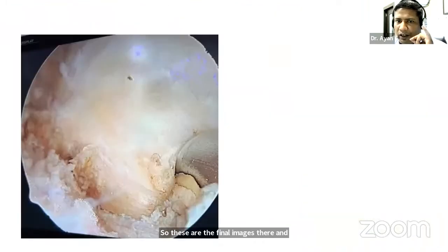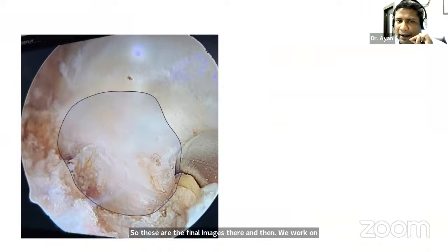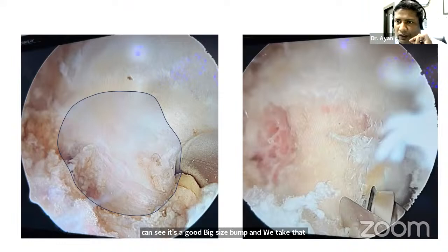And then we work on the cam part of the surgery. So this is a big cam bump, which was not very clearly visible on an X-ray and not even on an MRI, but examination wise, we can see it's a good big size bump. And we take that down with a burr, doing a good cam excision.